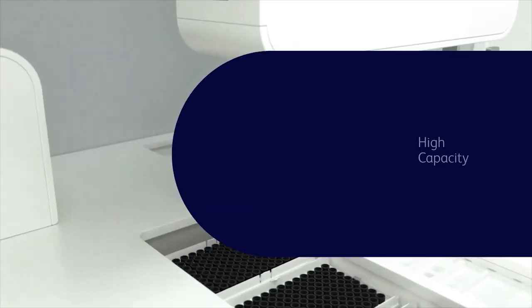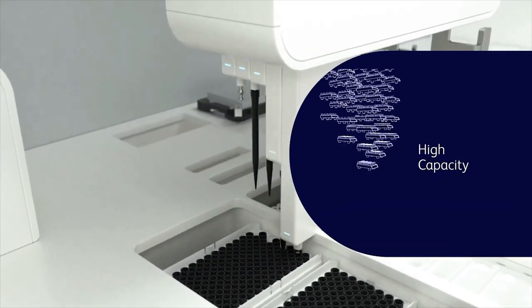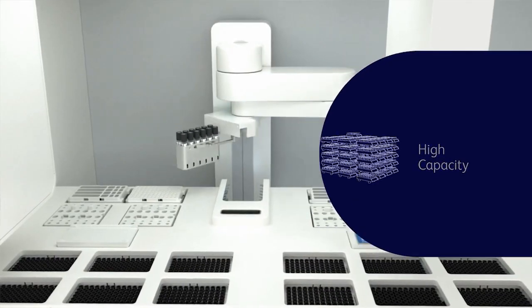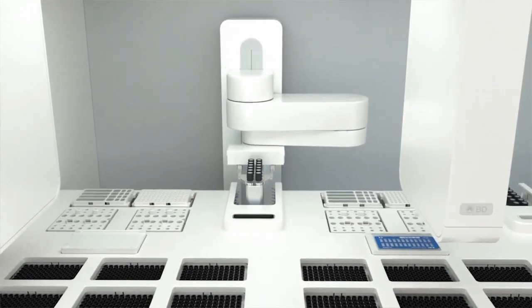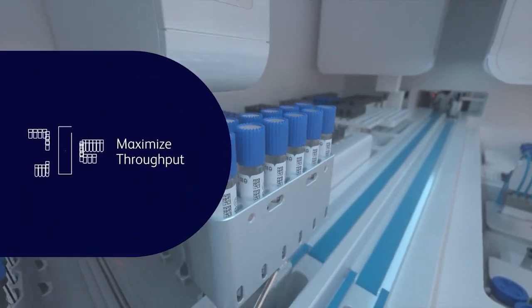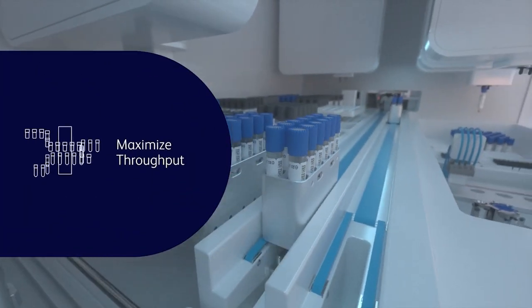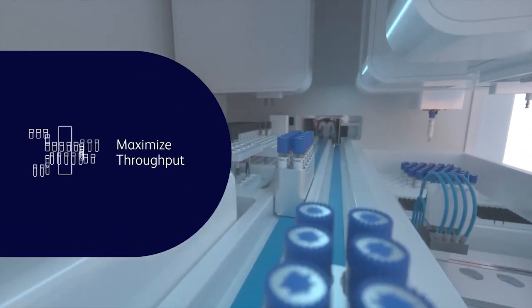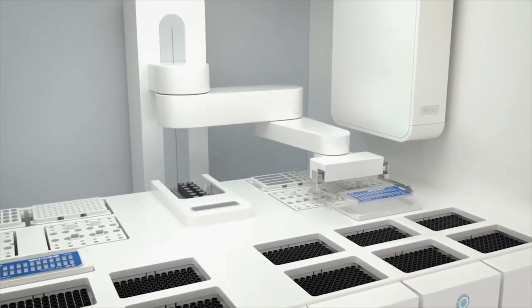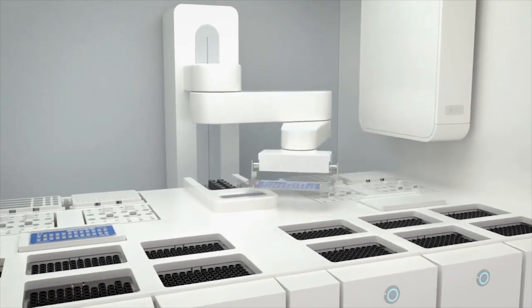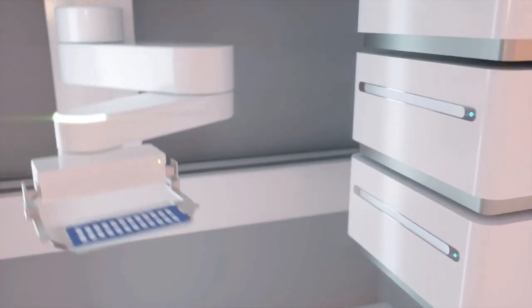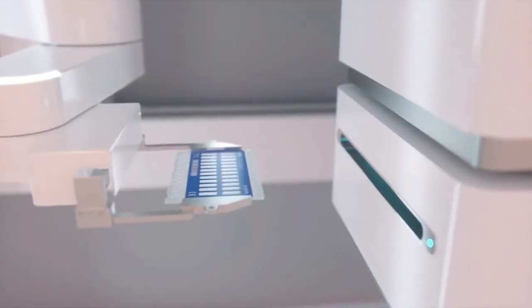Its high capacity for specimens, reagents, and consumables means it needs fewer user interactions. This allows you to maximize throughput while freeing lab staff to perform other tasks, and less time interacting with the instrument also reduces the potential for errors.